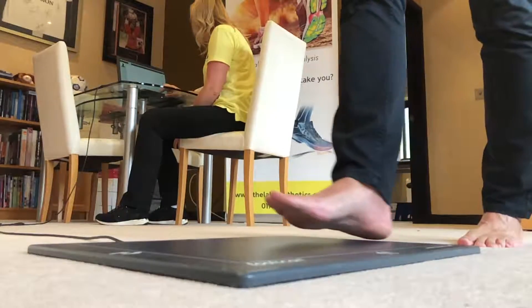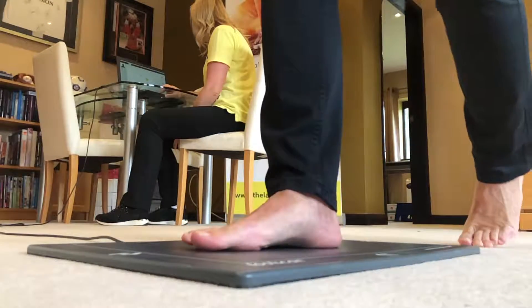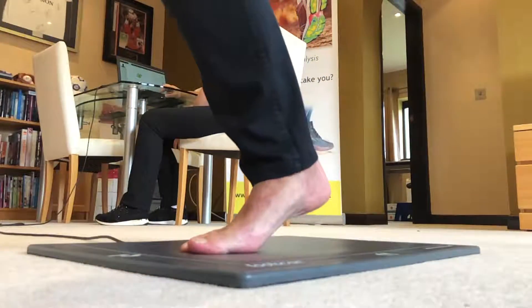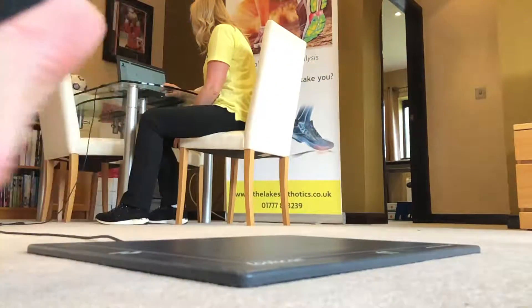By walking or running over the pressure plates, we can capture data regarding forces, peak pressures and loading during your gait cycle — information that would not normally be visible to the human eye.